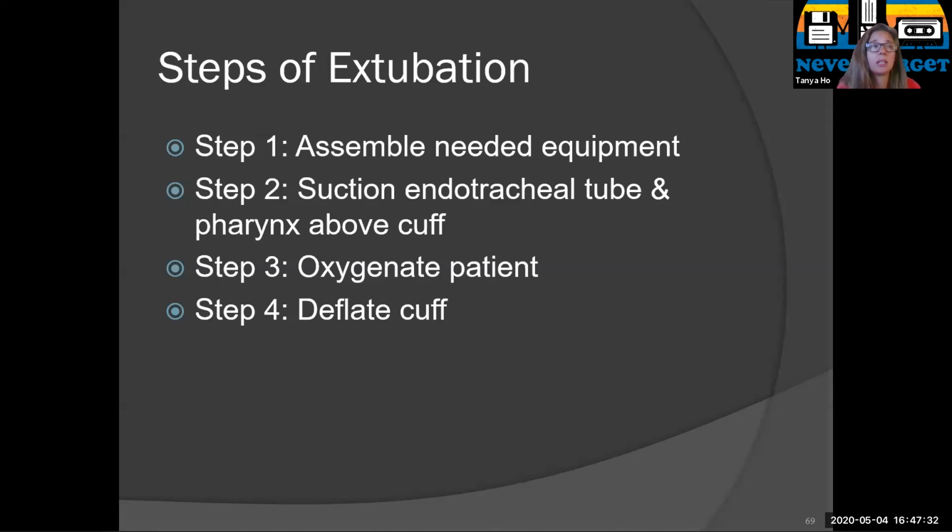I'm going to put a towel on their chest. Next semester, you'll do extubation, so you'll review this again, but basically you need to have your syringe ready, your manual ventilation bag with mask, suction equipment, and whatever you're going to put them on for oxygen and humidification after.